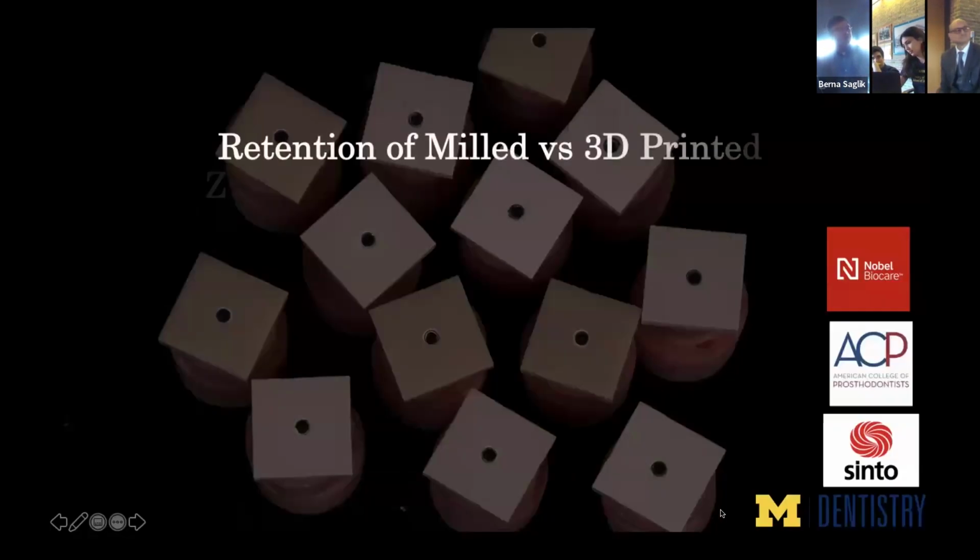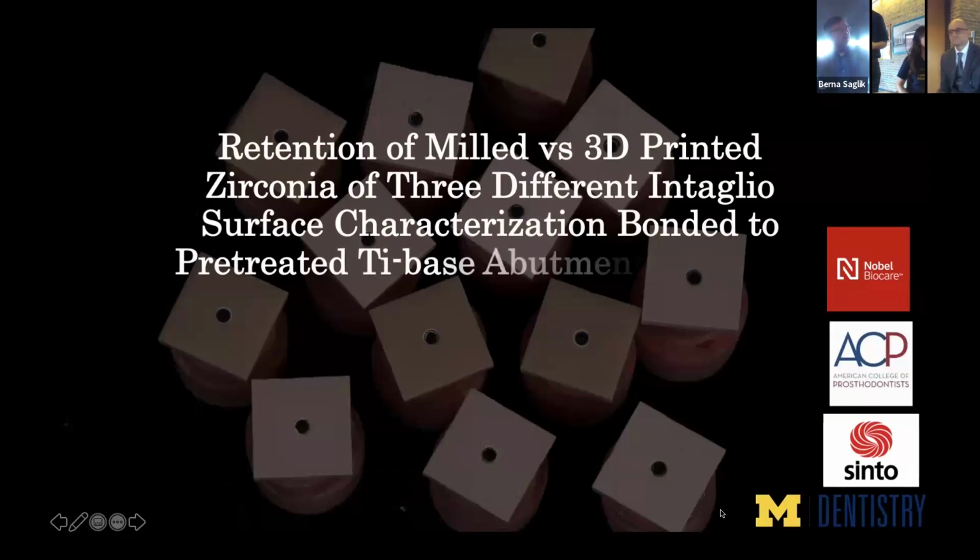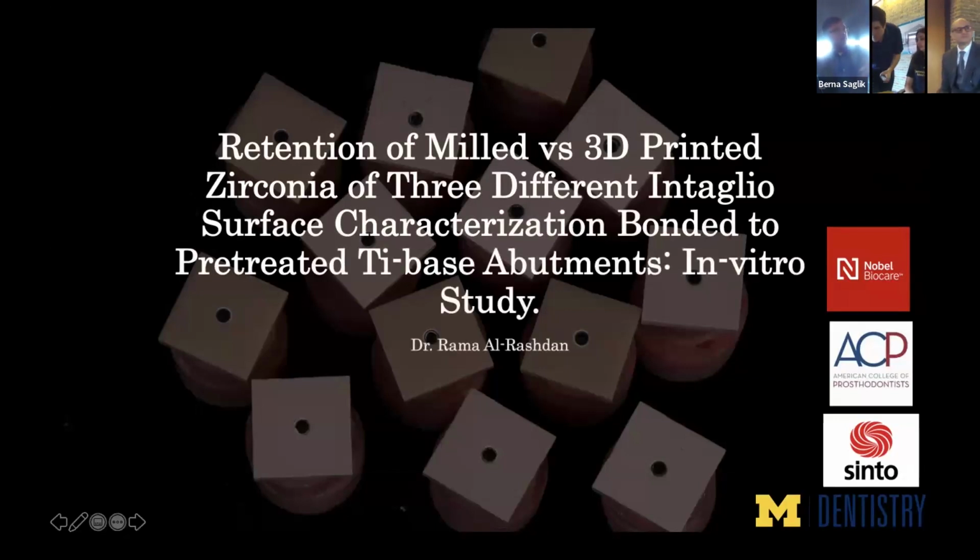Right now, it takes about 7 days from printing to final finished ceramic. So each batch would take approximately 7 days from, okay, we're good to print, we have a good scan, send that scan to the printer, print it out, and then finish it, clean it, debind it, sinter it. Takes about a week to 10 days.